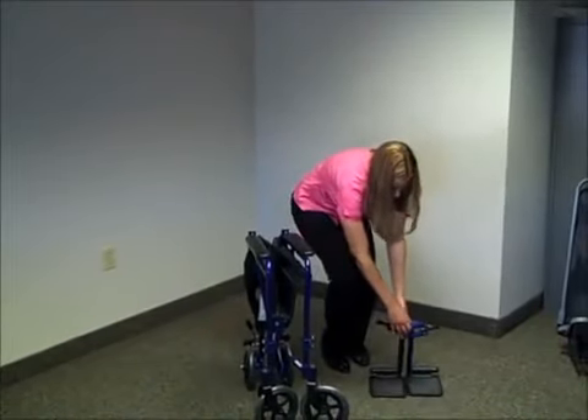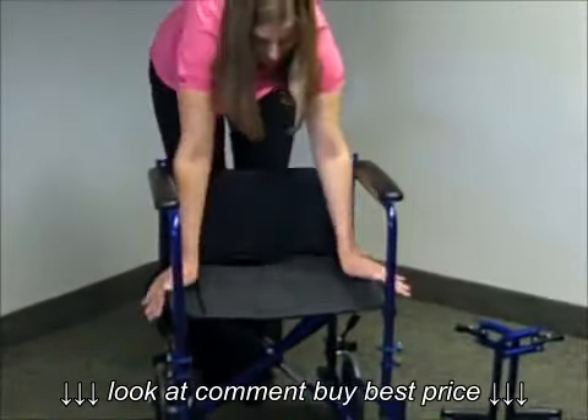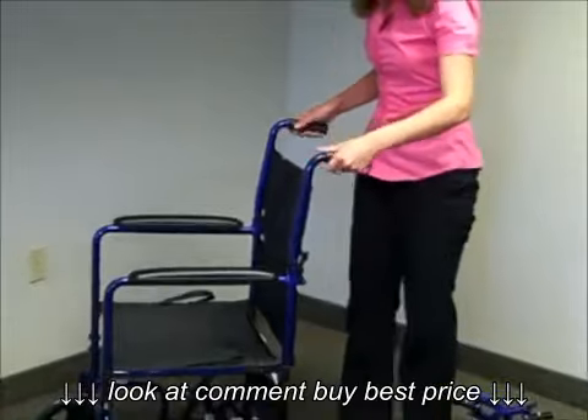The first step to open your chair is to grab the armrest and pull it apart. Make sure you press down on the seat just to make sure it's fully opened. Next you want to grab onto the handles and simply push up until you hear that click.